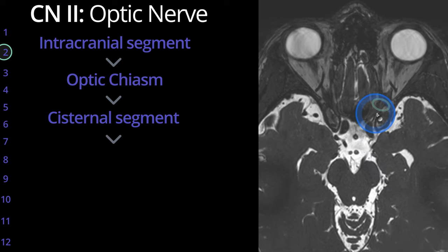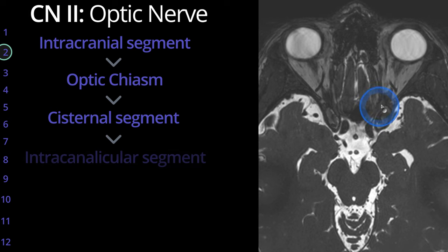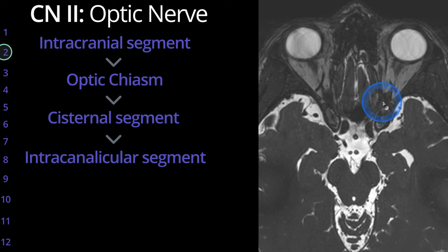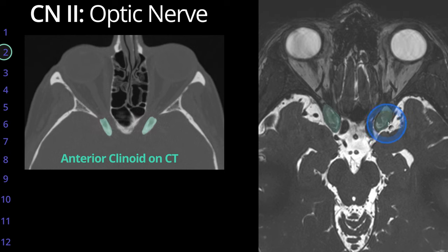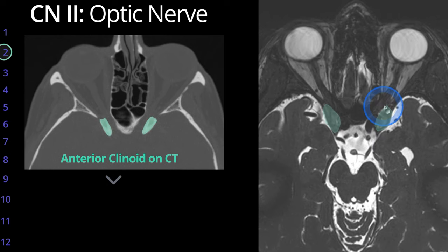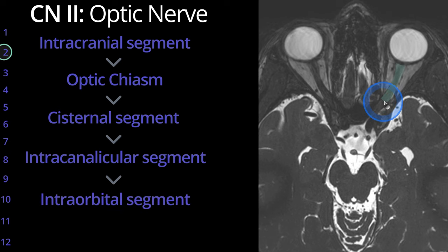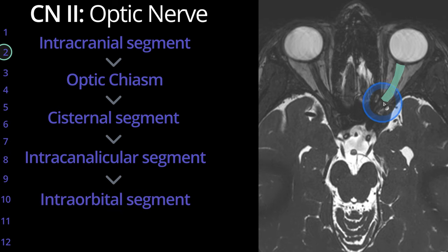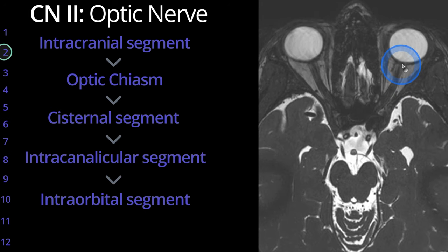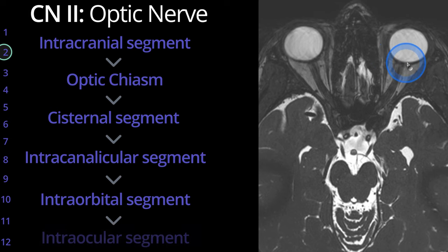These nerves then pass through the optic canal. This hypo-intense region is the intracanalicular course of the optic nerve, immediately anteromedial to the anterior clinoid process. Once the optic nerve passes through the optic canal, it becomes the intraorbital segment, traveling in the optic nerve sheath anteriorly. The short segment as it inserts on the posterior globe is known as the intraocular segment.